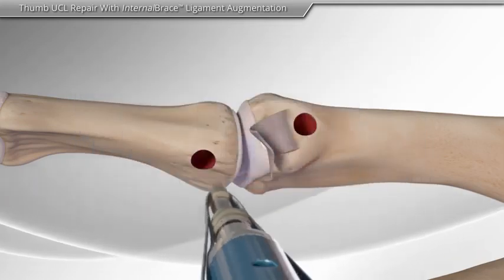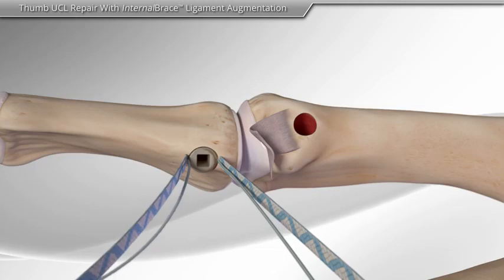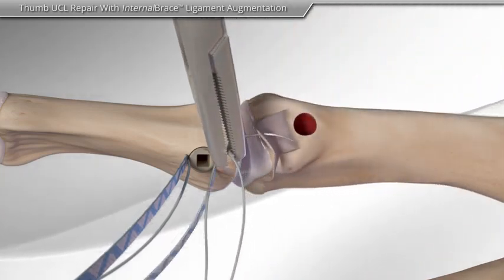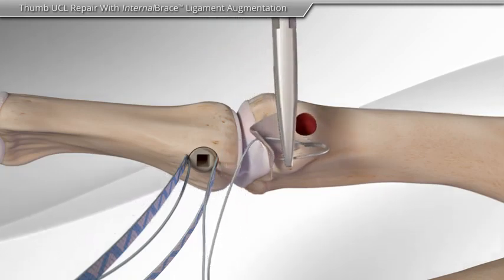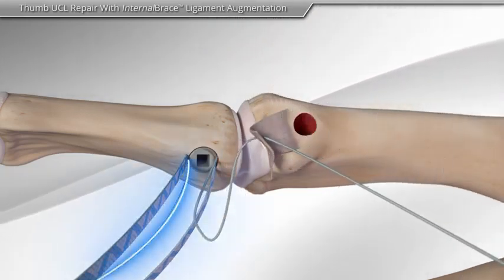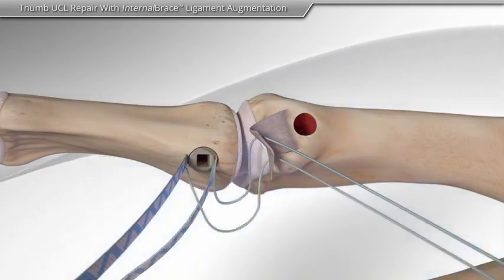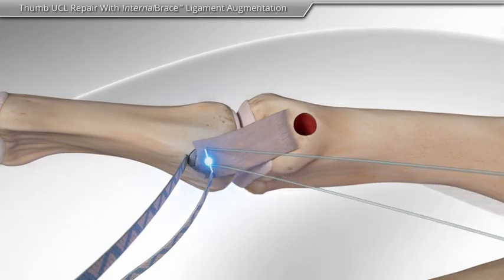Next, the surgeon inserts the first anchor with the fiber wire suture and suture tape into the bone. Then your surgeon repairs the torn ligament with the suture onto the original insertion point. These sutures are then cut.